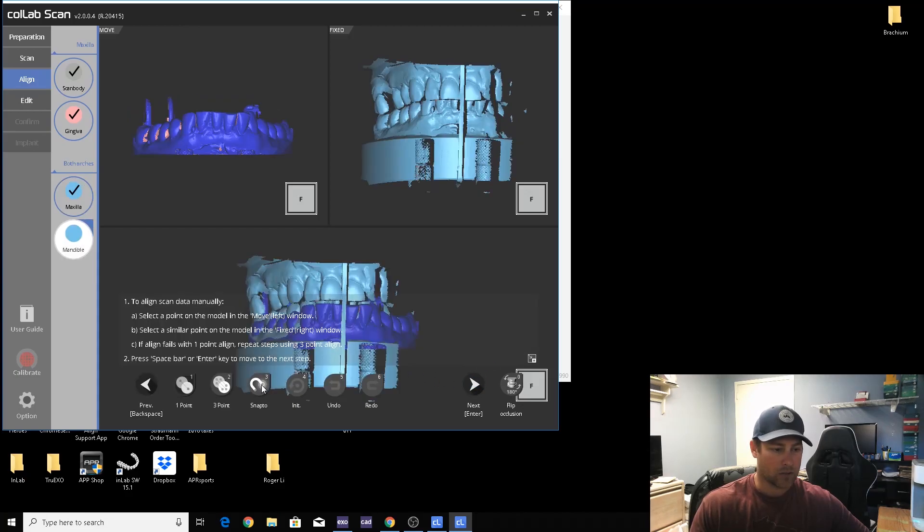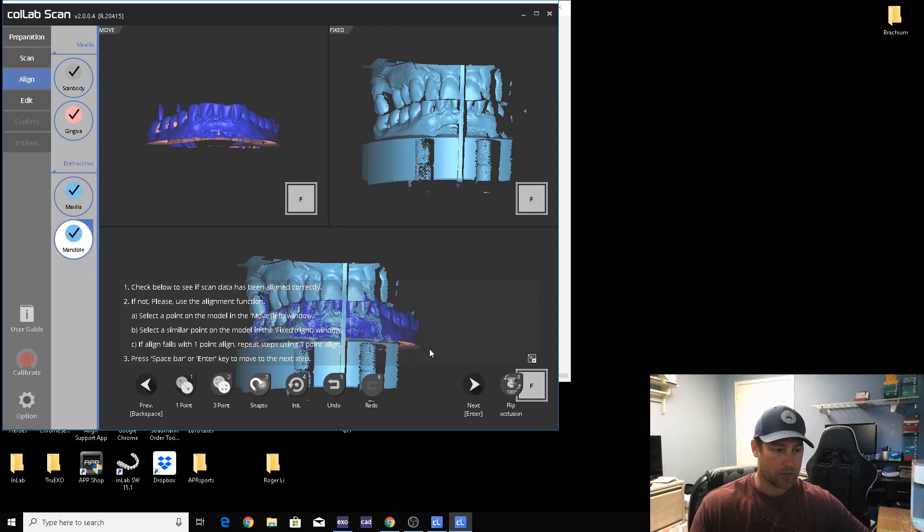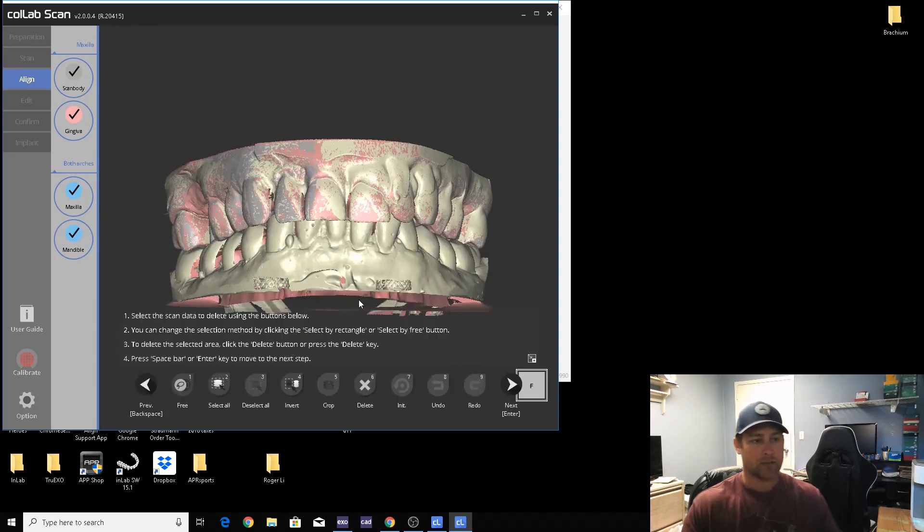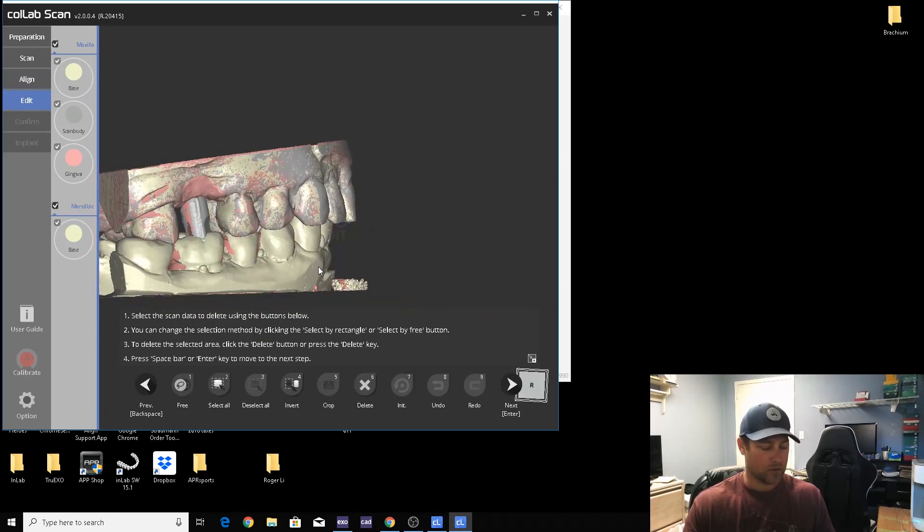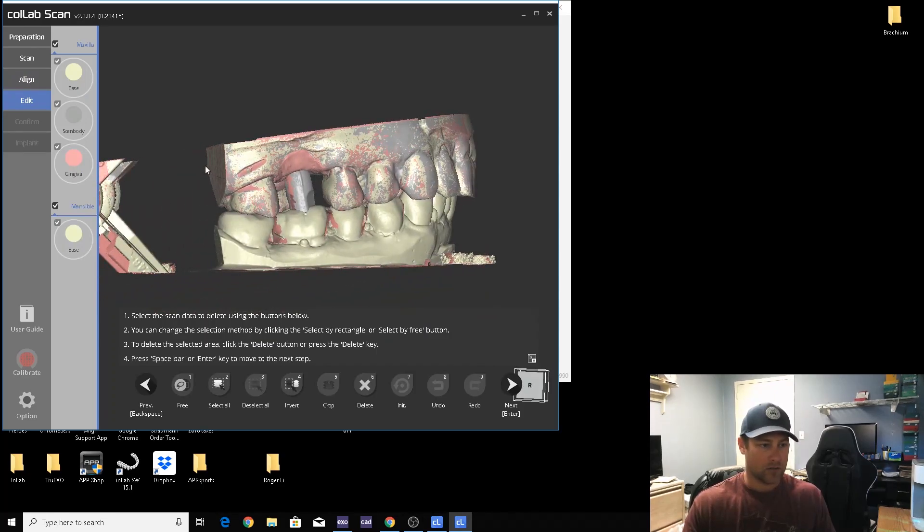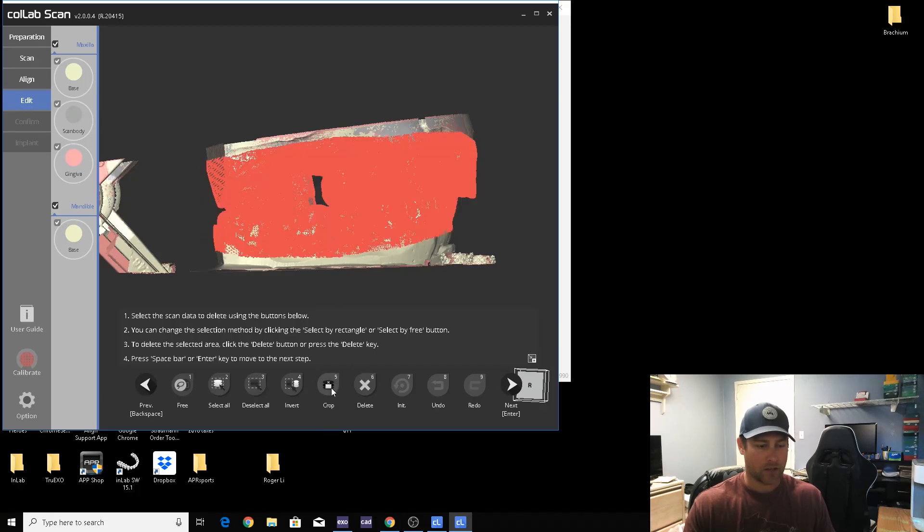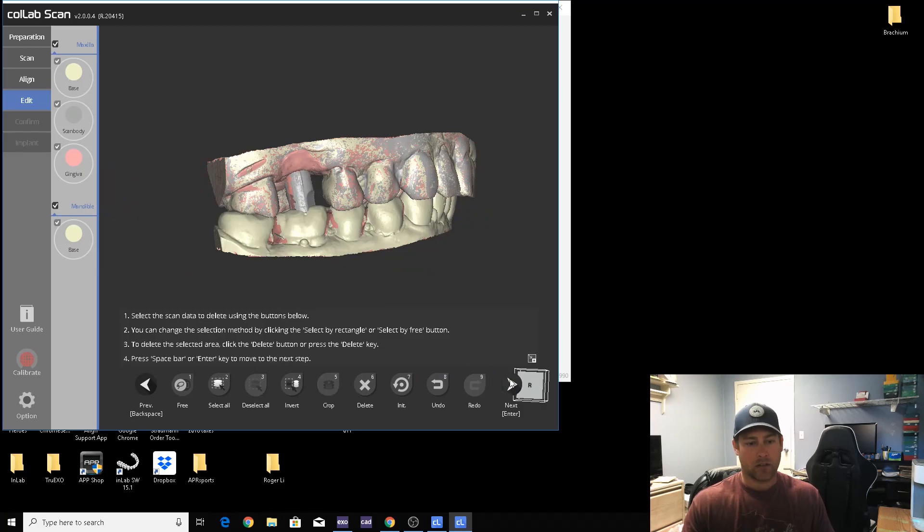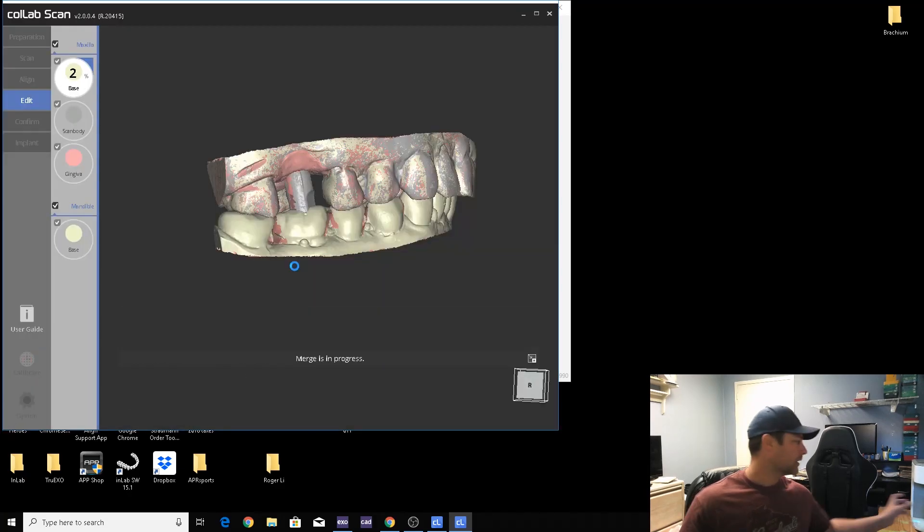And lower, just hit snap because it's already pretty close, and it snaps into place. Last, we'll go ahead and edit. Highlight everything that you want to keep and crop. And now we will merge everything together.